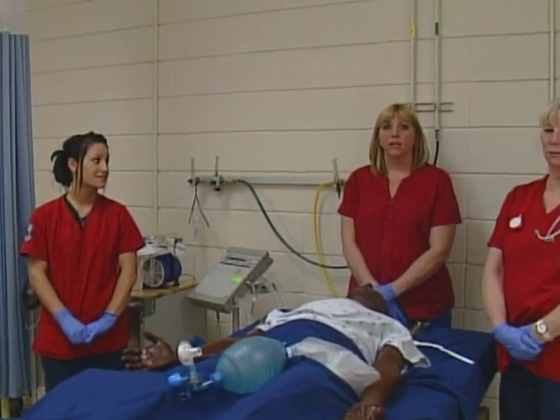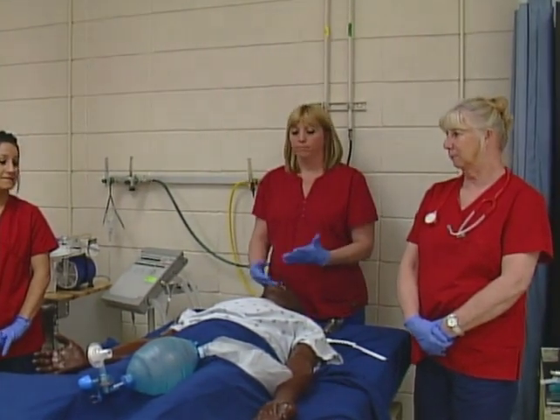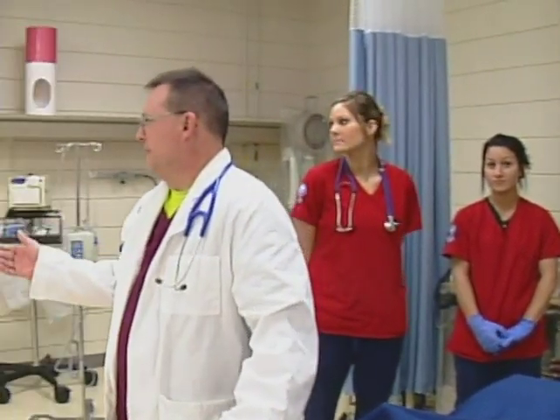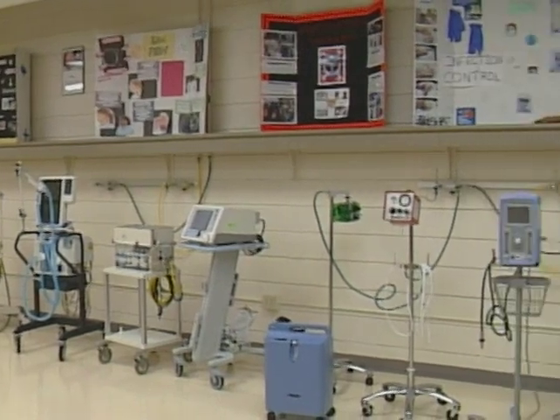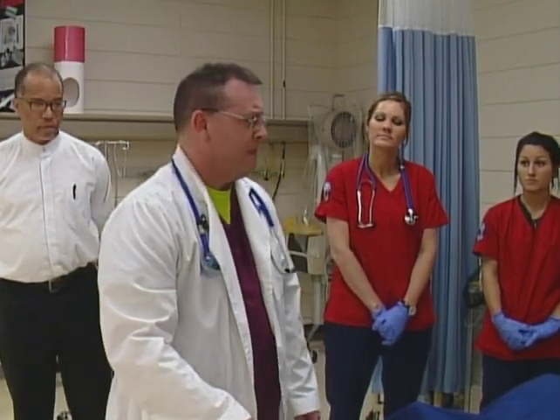We are excited today to introduce to the Board of Trustees some of our simulation mechanics and materials that help us improve our lab techniques. As you look around the room, you can see a variety of equipment that allows us to practice our techniques, allows us to actually get better, make sure that we're flawless in our execution of our therapeutic interventions. So when we get into a clinical environment where there's much more risk, we're confident we can perform flawlessly.